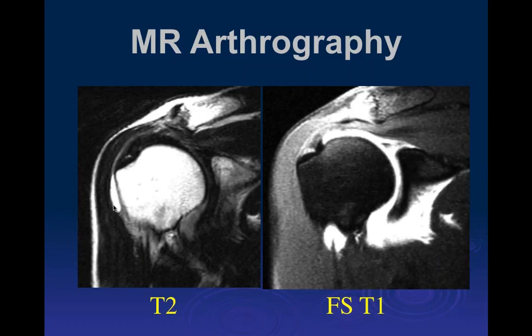Yeah, so there's a little bit of fluid in the bursa there, which kind of blends into the overlying muscles there. But you're not seeing that fluid. No. Not seeing that at all, no. So what's going on here?